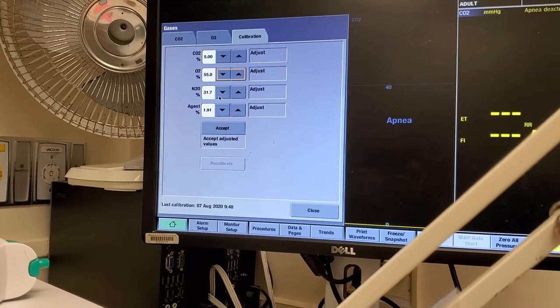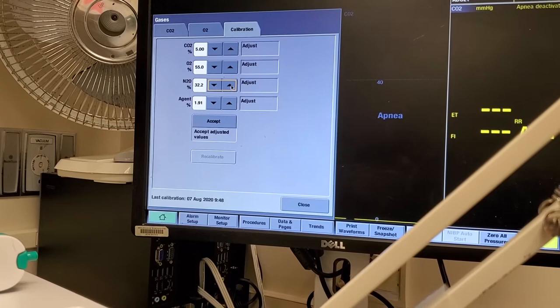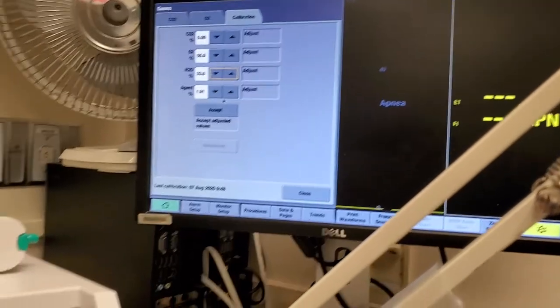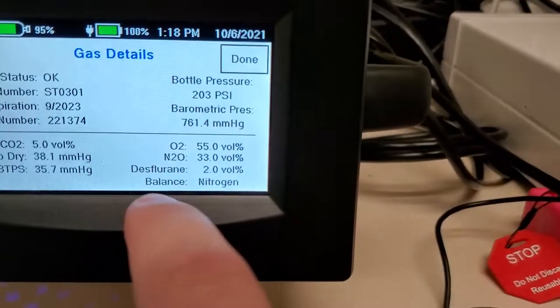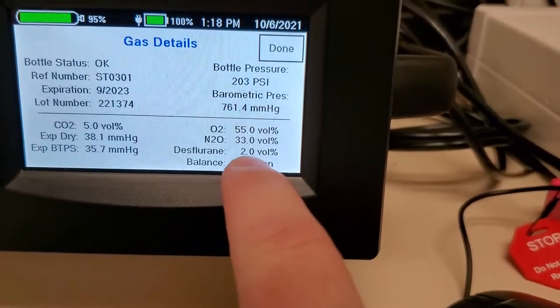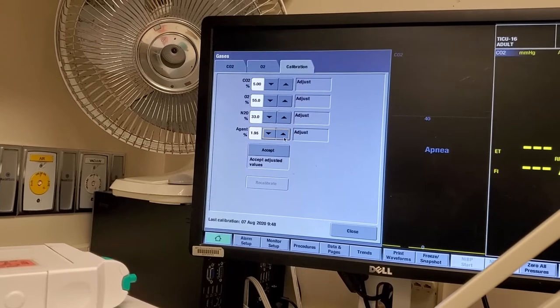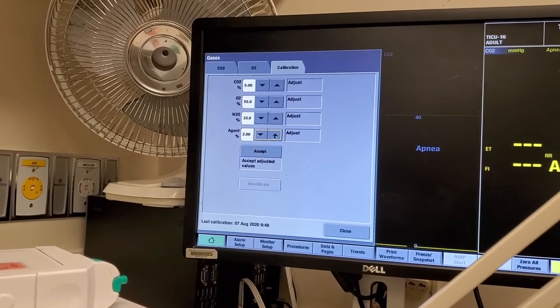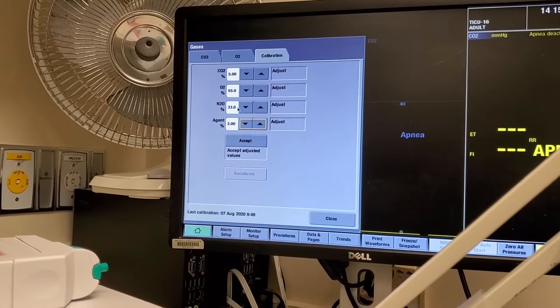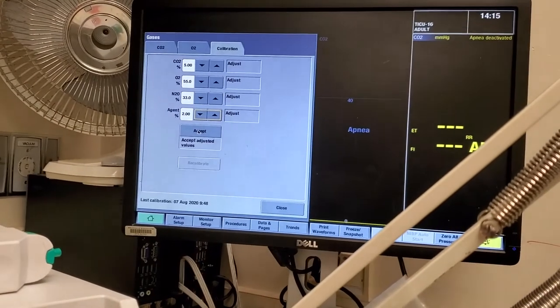N2O is going to be 33%, so I'm going to turn this one up. And agent percentage — this module does recognize that there is an agent. You can see desflurane is 2% by volume, so I need to turn it up to 2%. Let's do a second check: CO2 5.02, O2 55, N2O 33, agent 2%, and accept.